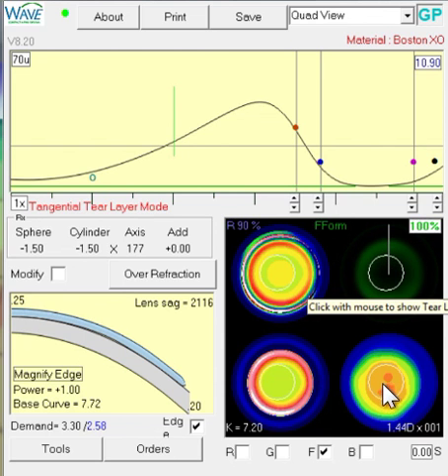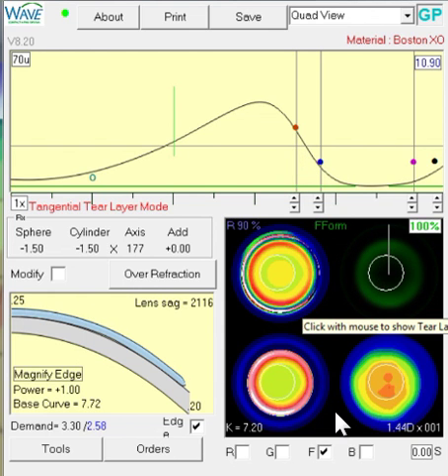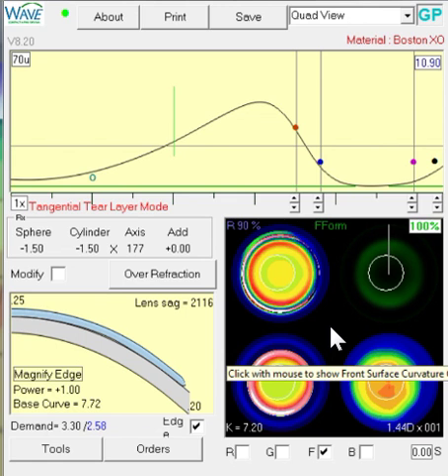In cases where the astigmatism is fairly apical, where it's mostly right in the center towards the visual axis and not really limbus to limbus, adjusting just the topo demand without going to an oval optic zone seems to work okay, but going to an oval zone will work just fine as well, so I'll just demonstrate both ways.